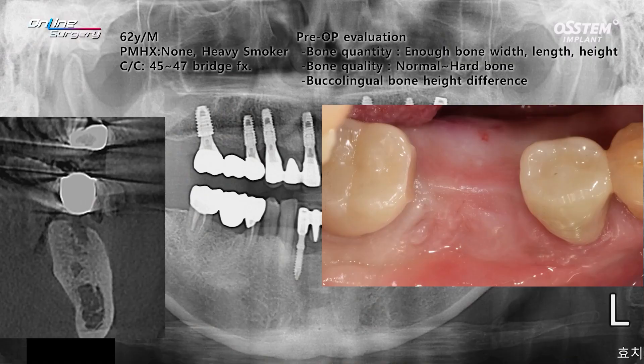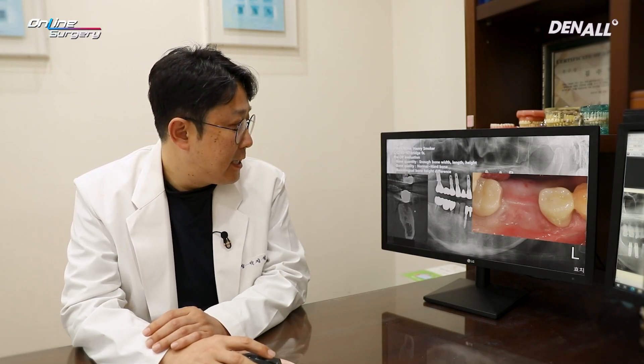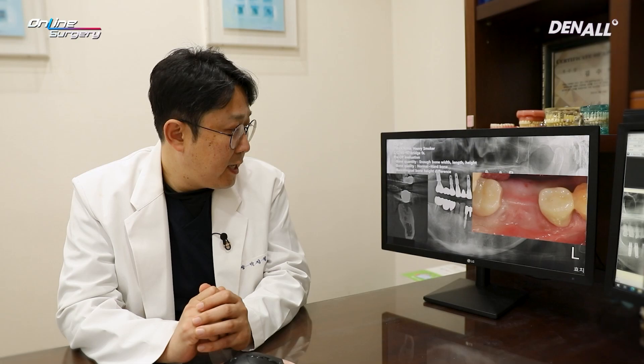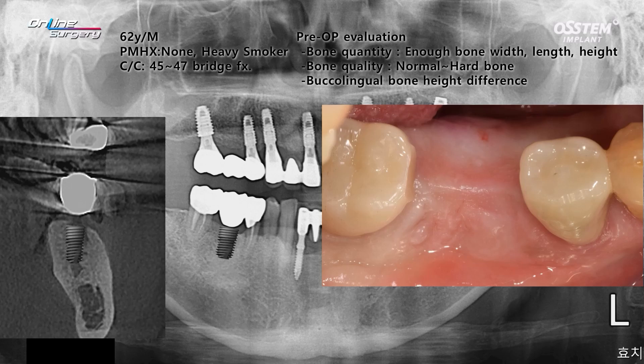In terms of bone quality, observing the bone loss pattern on CT, normal bone and hard bone can be estimated. Tooth extraction was conducted about two years ago. A little bit of defect is observed, but it would not interfere with implant surgery. However, on the buccal side and the lingual side, the bone levels are different, so the depth of implant placement needs to be considered — whether to place the implant a little bit deeper or allow one thread to be exposed on the crestal side. Even though a little bit of thread is exposed, I don't think that would pose a major problem, so an implant would be placed according to the plan.